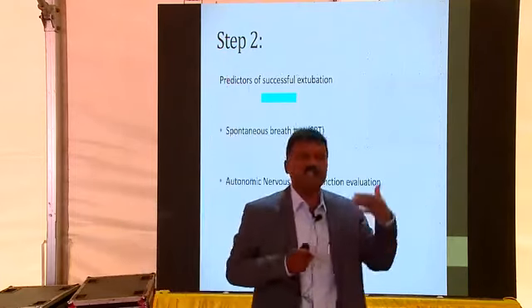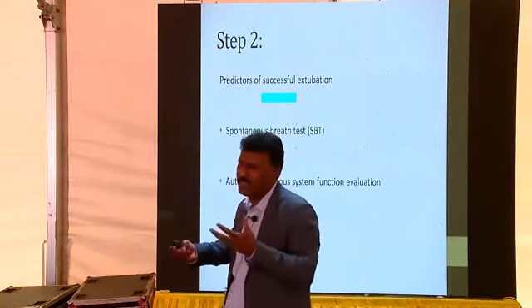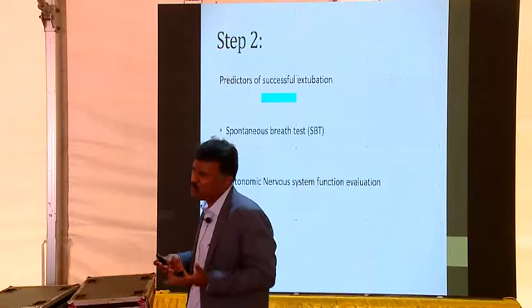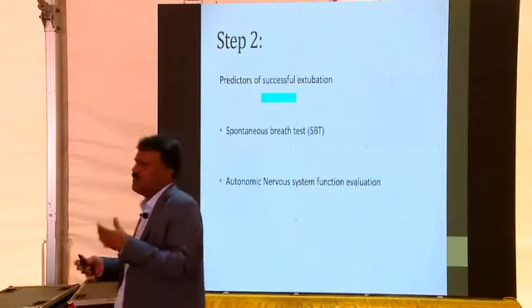There is still no guarantee. So it's still not the best test, but you could try this in case you have a doubt. I'm not too sure whether I should extubate him or not. Put on a spontaneous breath test and see for 5 minutes.